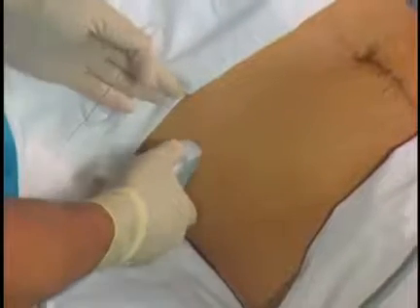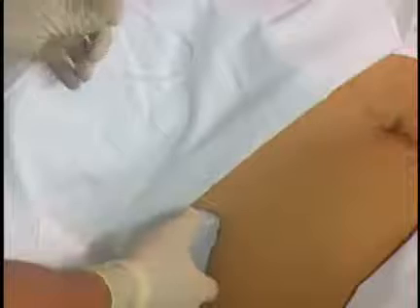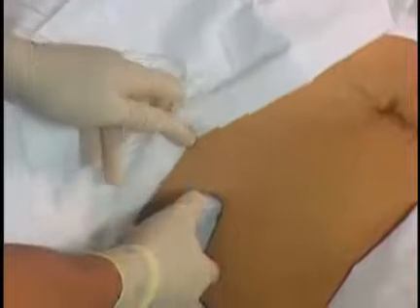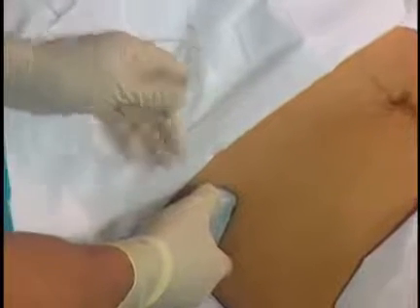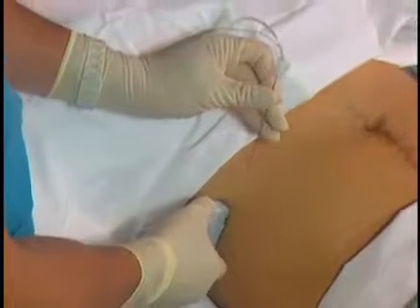For higher surgeries, you may want to perform the same block higher up. It's the same block using the same muscle planes, just given a different name — some people call this a transversus abdominis plane block, or TAP block. Here we have moved just below the costal margin, slightly cranially. I will use the same needle position and advance it cranial to caudal. By moving higher up, we hope to get spread a few dermatomes higher, potentially up to T7 with larger volumes. The volumes I usually inject here are 10 to 20 milliliters on one side.